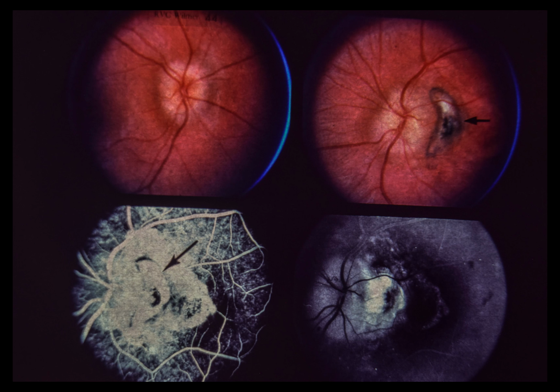Lower right. 30 minutes following dye injection, the hyperfluorescence in the center of the macula has faded almost entirely, indicating that this was a transmission defect or an RPE window defect. The area of subretinal neovascularization, however, appears brighter, indicating continued leakage of fluorescein dye.